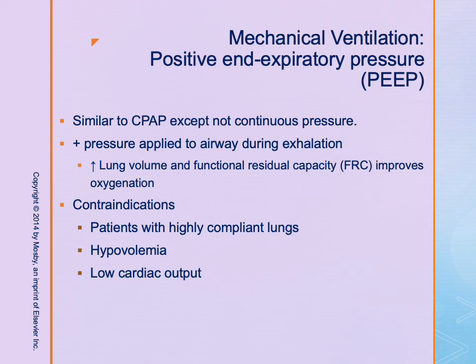Since PEEP increases lung volume and functional residual capacity, the FiO2 can often be reduced. So that is also another benefit of using PEEP.